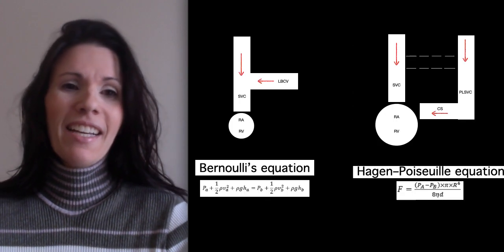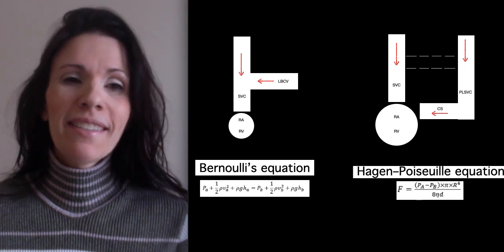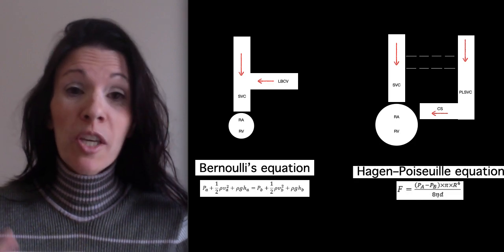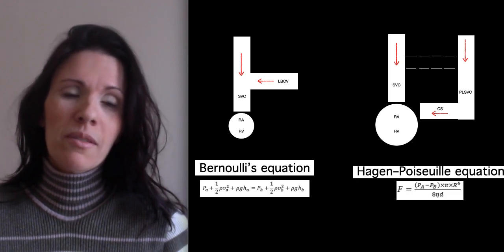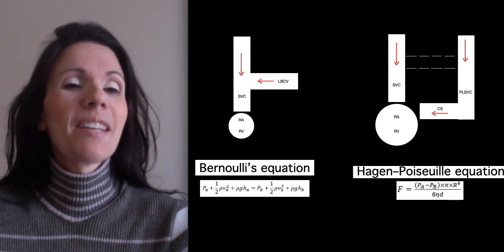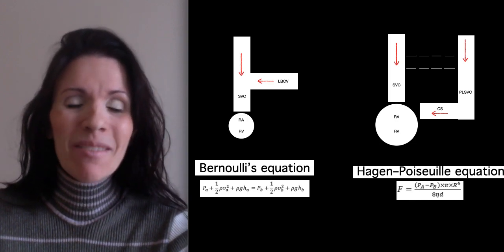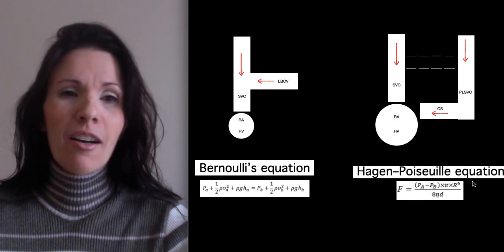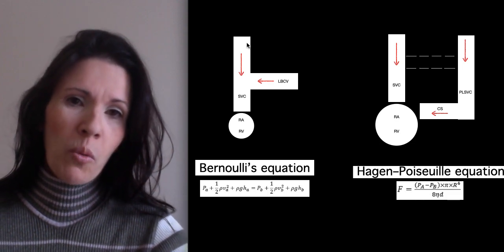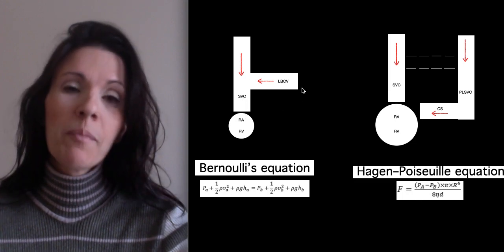And how can you explain these right chambers bigger than left chambers? We have some equations, I cannot understand, this is too complicated, but you can even understand by this schematic drawing. Here you have a normal heart with just one superior vena cava.